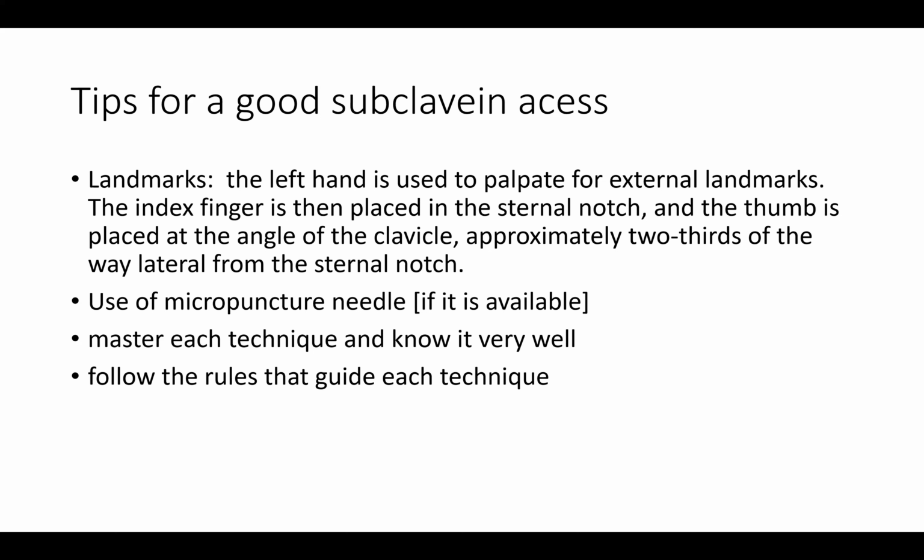Another tip that we should also go home with is to master each technique and know it very well. Don't rush to learn everything without knowing one very well. In Sub-Saharan Africa, I will advise you, learn the blind puncture and be a master of it. Then two, the fluoroscopy and be a master of it. Then three, the venogram and be a master of it. If you have these three, fine.